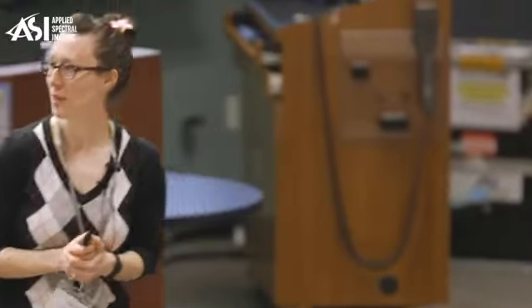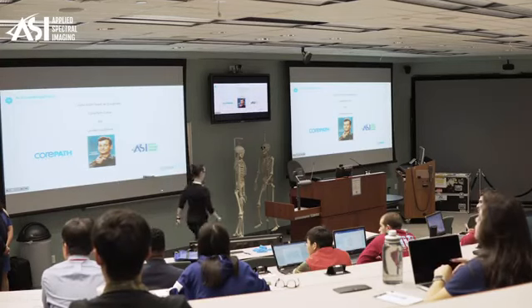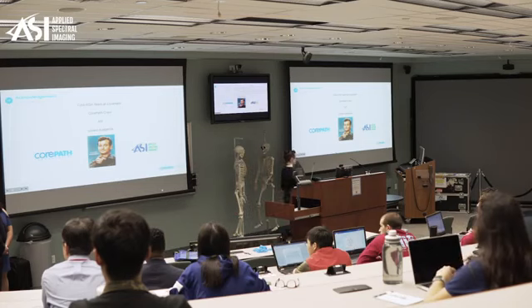Is there a question on Genesis Anywhere? Yes. What was the question? If with Anywhere you could work remotely. It has the potential to, but at our lab, we work on site. The Genesis Anywhere software is designed around the concept of being able to remote in from a remote area and do full analysis capabilities, not just review capabilities. So it can be used as a remote workstation.